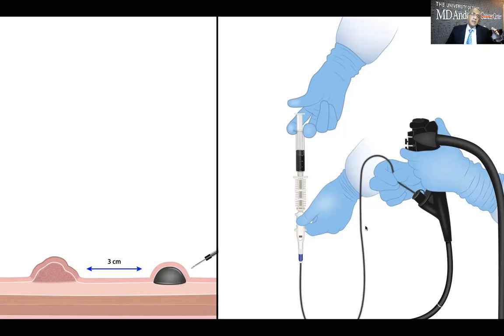If you know that your patient has cancer and you want to mark it, then you have to do either 3 or 4 quadrants distal to the lesion and take a photograph of the tattoo with the lesion.